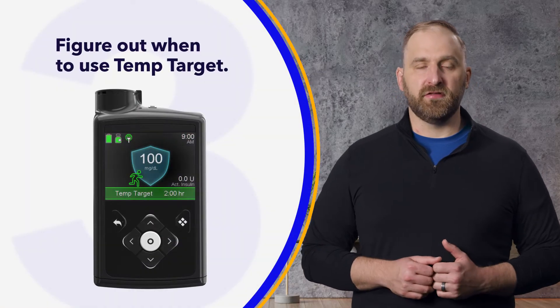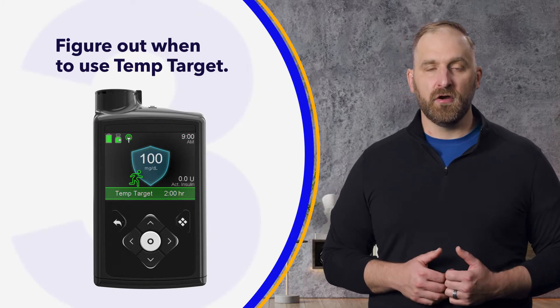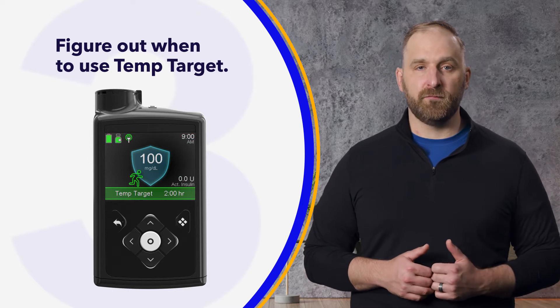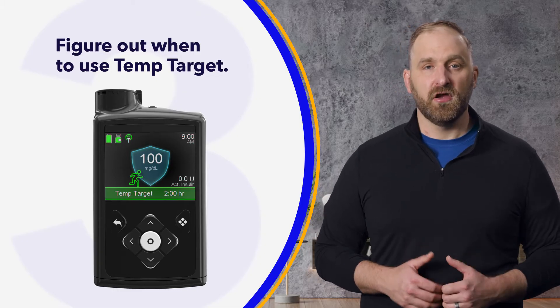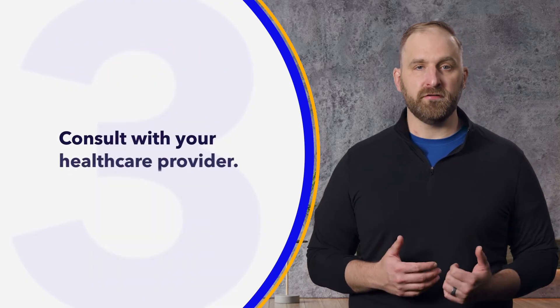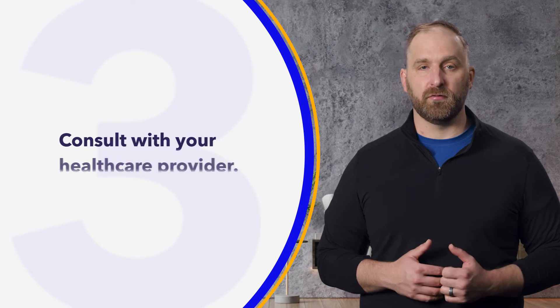Next, figure out when to use the temp target feature. You may discover the temp target can be helpful for certain aerobic activities like running, but may not be helpful for anaerobic activities like weightlifting. This feature can also be useful for exercise during certain times of the day to help keep your sugar in target. Regardless of when you decide to use it, it's a good idea to consult with your health care provider.